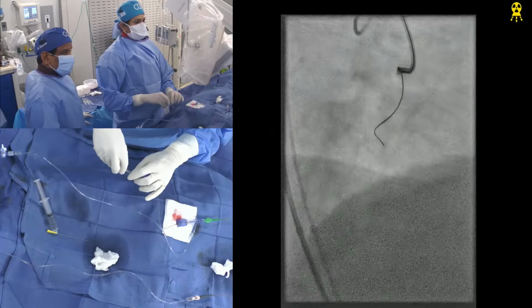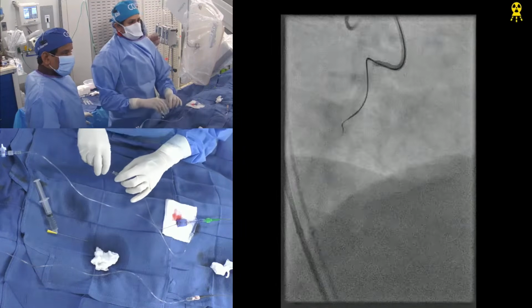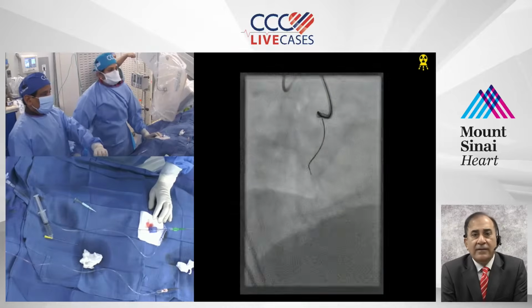We may have to go into the... We can take a little subintimal picture when we want. Anu, if you're proceeding with the Gaia, then we would like to see the pre-shape of the Gaia.